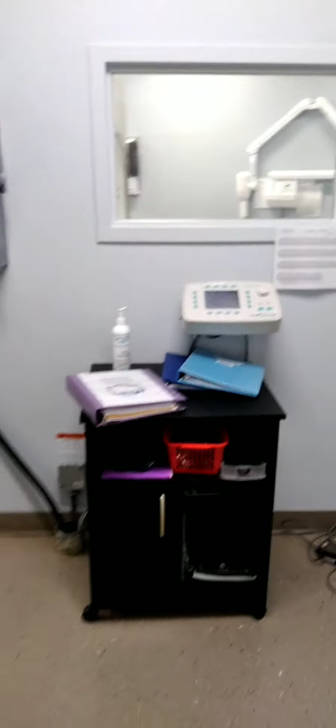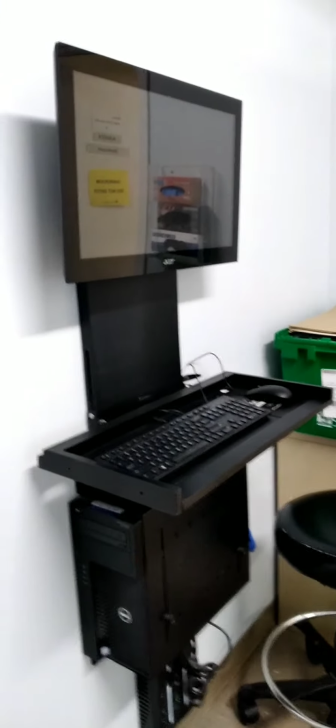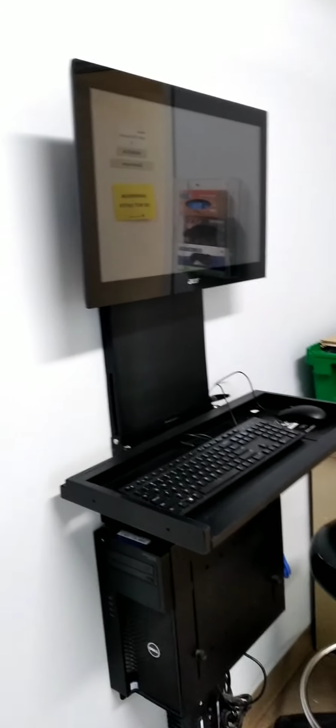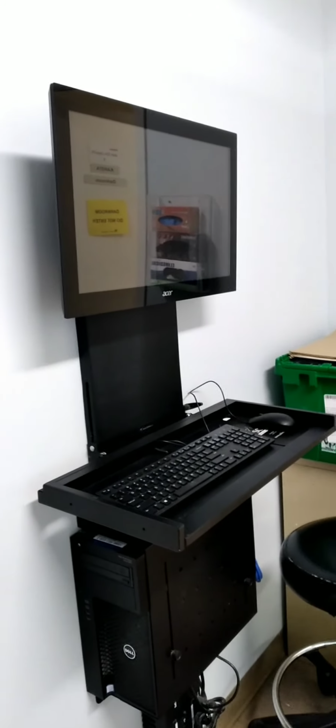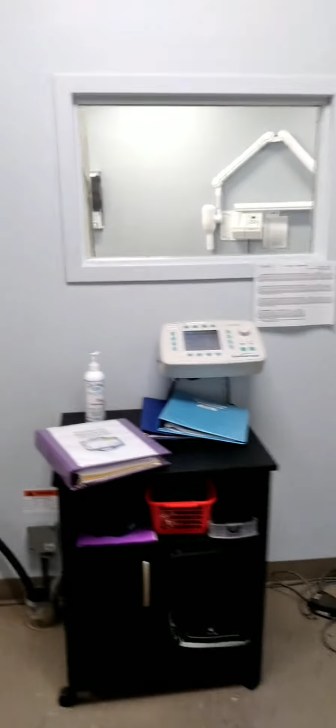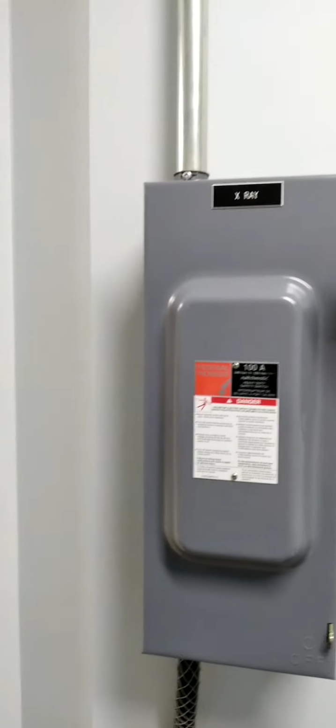So when you first come in the door, this is a bit of a vestibule, a lobby area. This is where the digital unit is contained. All of this black stuff here, the black monitor, the black keyboard, the black computer, this is all part of the digital unit that we will show you in 312 a lot more at length. Right in front of us is the line voltage breaker. Currently it's in the on position.